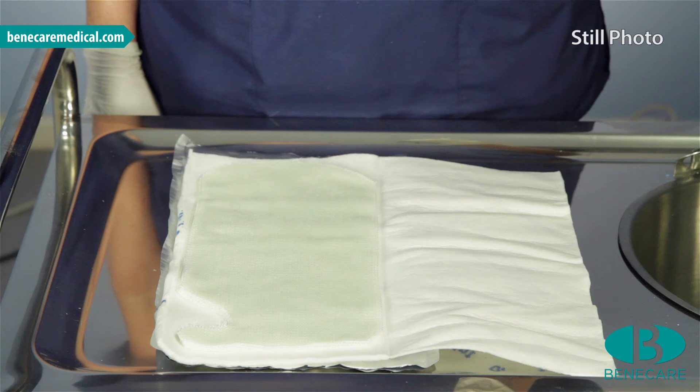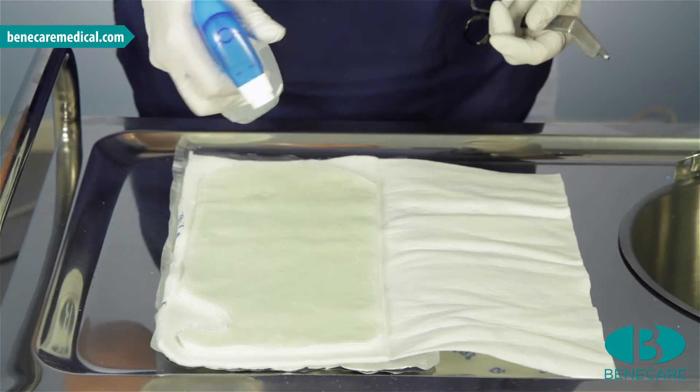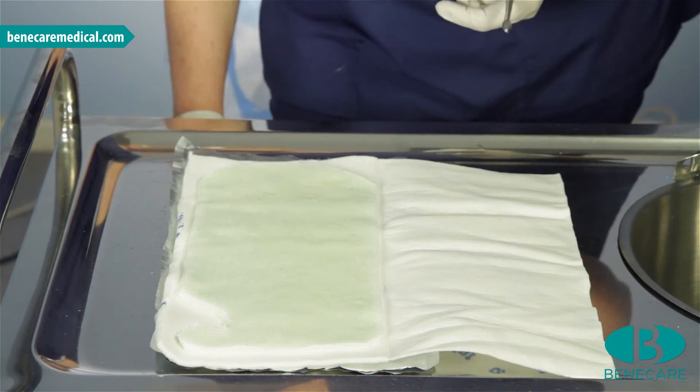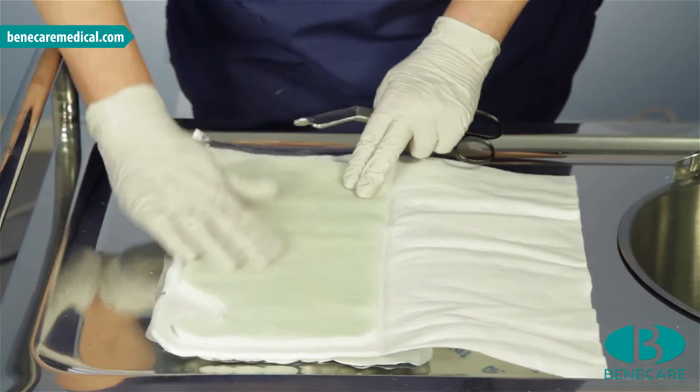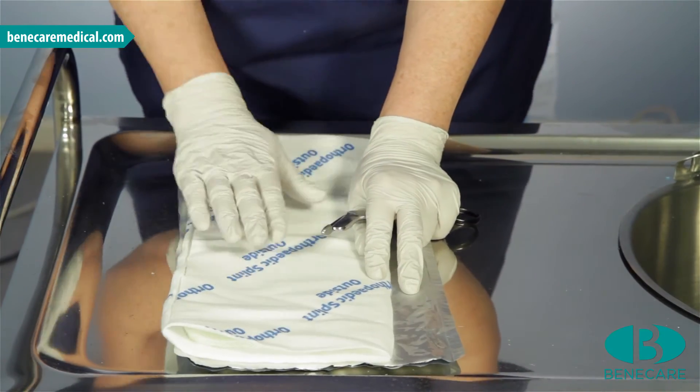You may wet the splint by using a water bottle, a spray, by running it under the tap or dipping it in the bucket. However, it will need to be wrapped in a towel to absorb the excess moisture if dipped into the bucket. Today I am using a spray. Wet the splint on the side with the writing that will be away from the patient. After spraying the splint, fold over to penetrate the moisture through the splint.